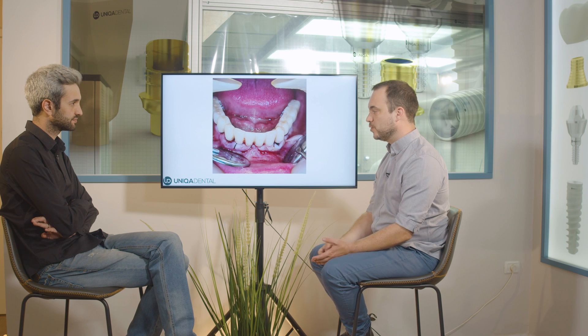So the frontal part is not supported on any implants? Yes, right now, because we want to wait for the osteointegration. Even though we already have most of the support from the posterior implants, now we can also mount on the anterior implants — it's not a problem in my opinion.